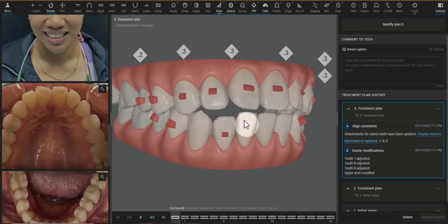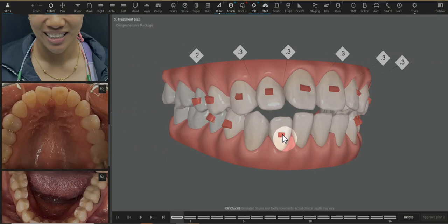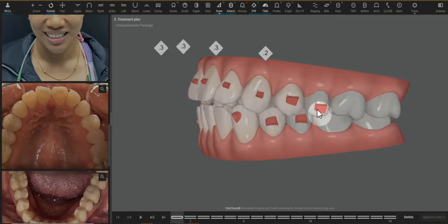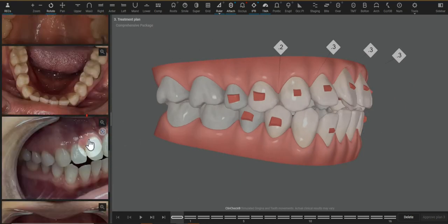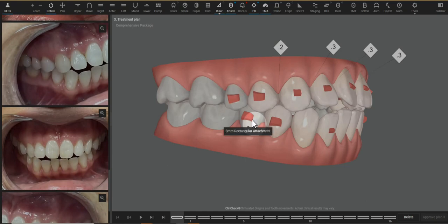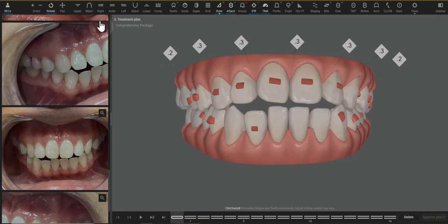I have this anterior open bite case ready to discuss. You can see that the teeth that are grayed out are the teeth that are not moving in the case. Based on where she's initially biting and her photos, there doesn't look to be a need to actively move the second premolars.